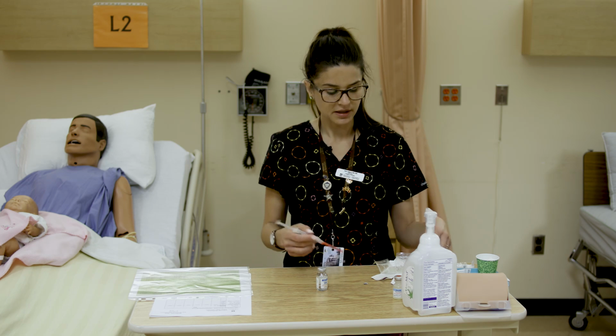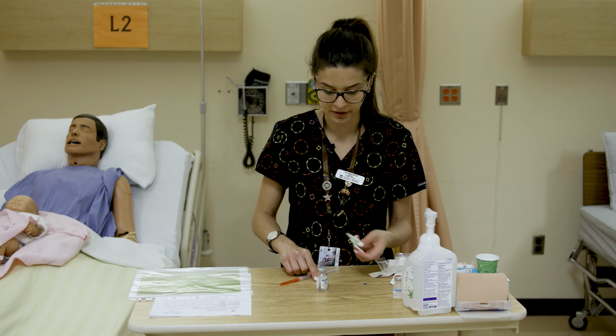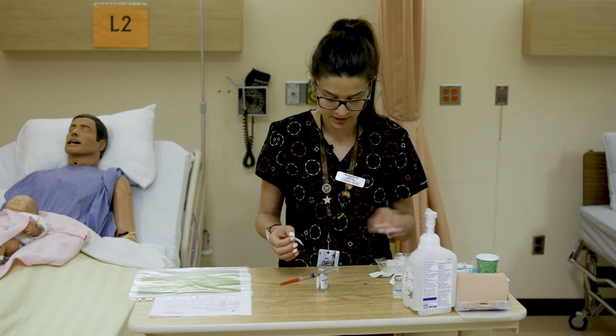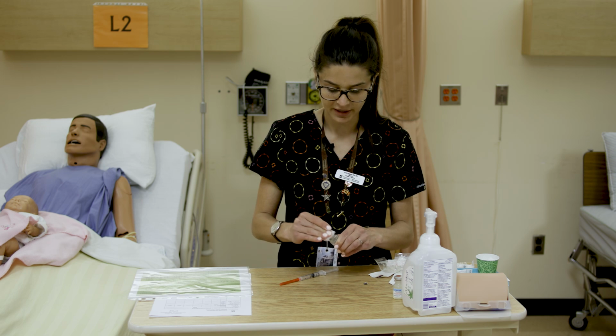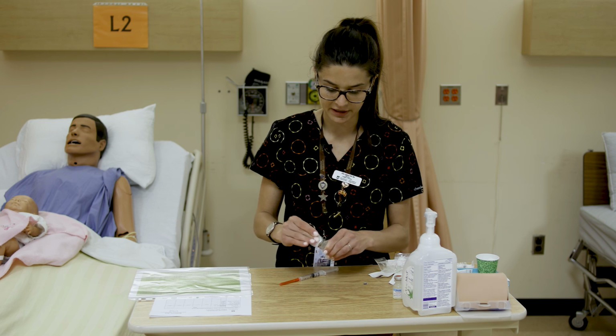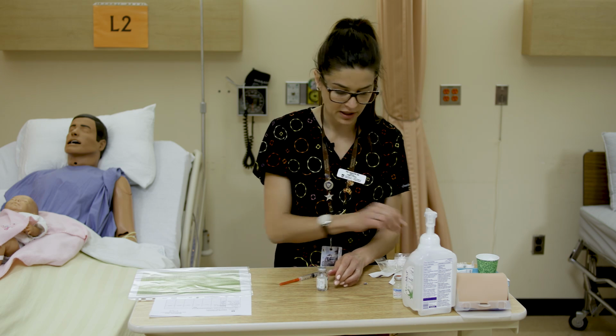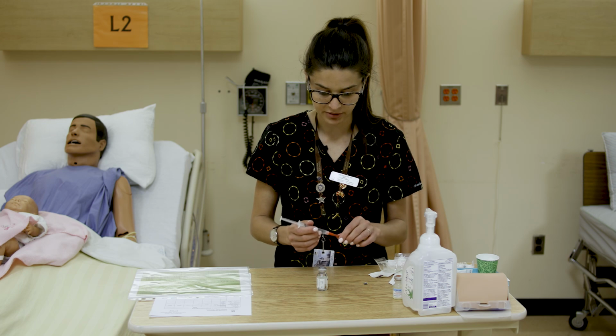And if it's been a long enough amount of time, you can re-swab the top of your vial and let it dry. It's not a terrible idea. Especially if, again, it was one of those ones that took a while to dissolve and you had to set it aside and do something else in the meantime. You want to guarantee that that is clean before you inject or withdraw from it.